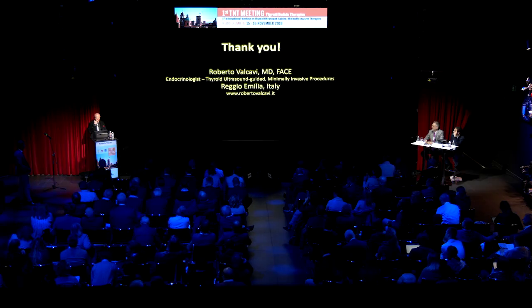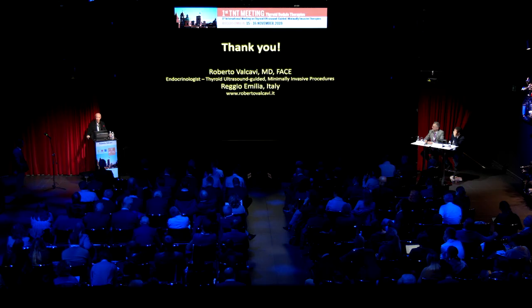In parathyroid cysts, ethanol may work. I have experience in parathyroid cysts as well. The problem is with the inferior parathyroid, which is very close to the laryngeal nerve. So laryngeal injury could be a problem in inferior parathyroid ethanol ablation.